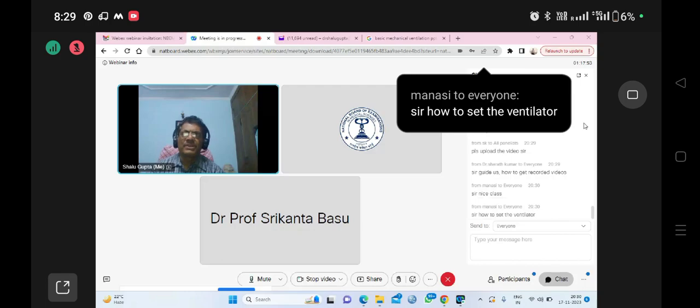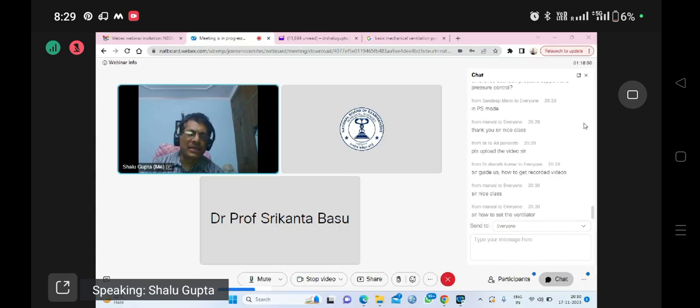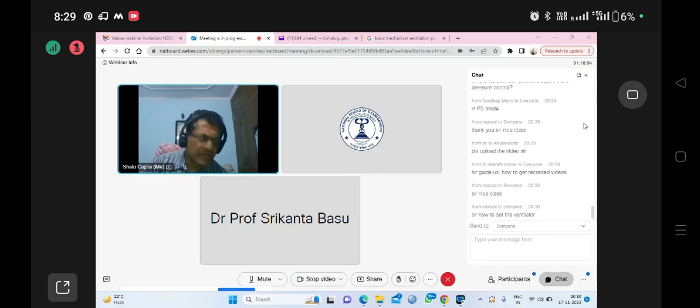Suppose there is a child who is having pneumonia and there is a problem in oxygenation. Whatever your target is, say to maintain a saturation of maybe more than 92% or 94%, you start with one setting, you apply a certain amount of pressure or volume depending on what mode you have chosen. And if you're not able to achieve that desired effect, then probably you need to hike up your settings and achieve that target volume.